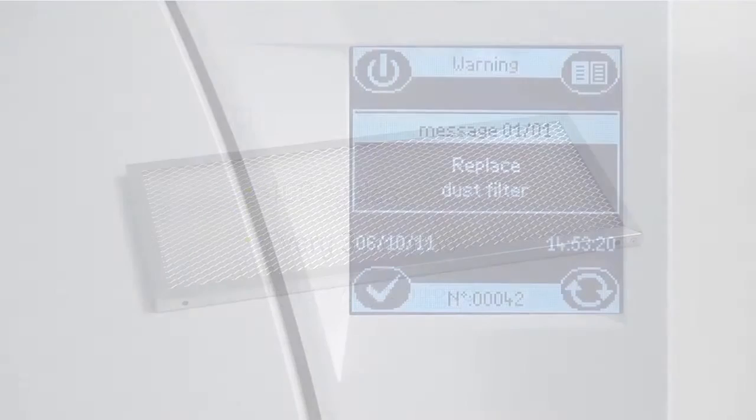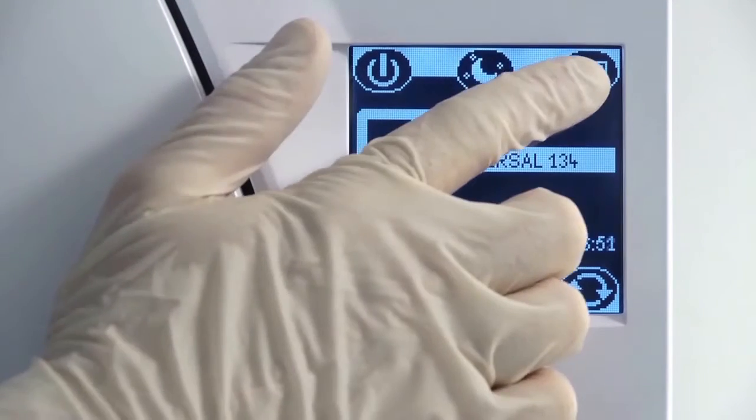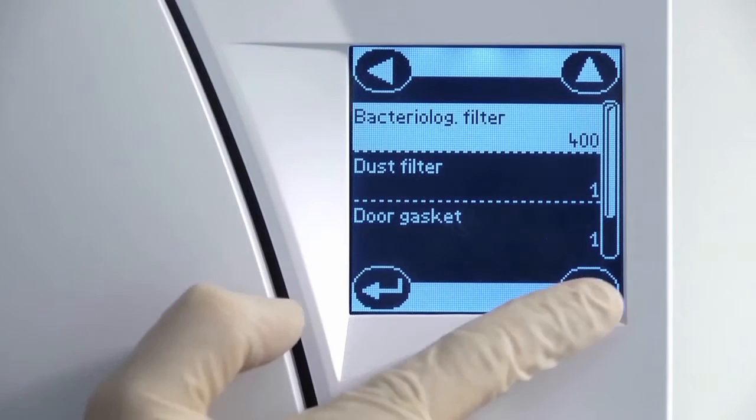Your Leaser steriliser will automatically prompt you when the life of the dust filter has expired and needs to be replaced. Alternatively, you may view the number of cycles remaining for the filter from within the maintenance screen of the menu.